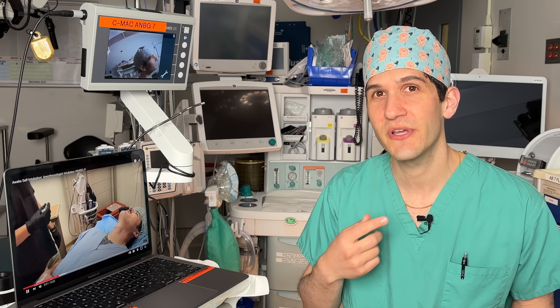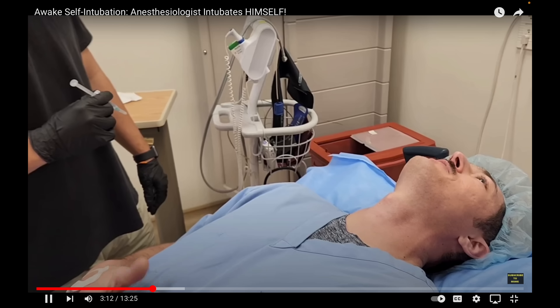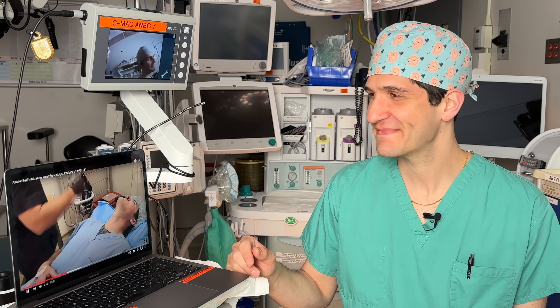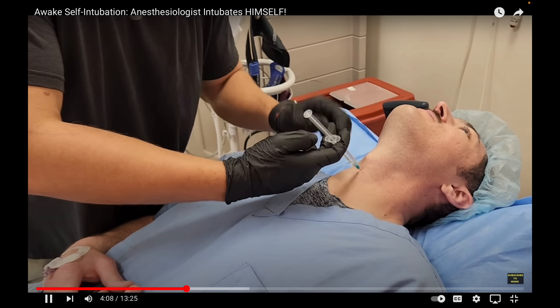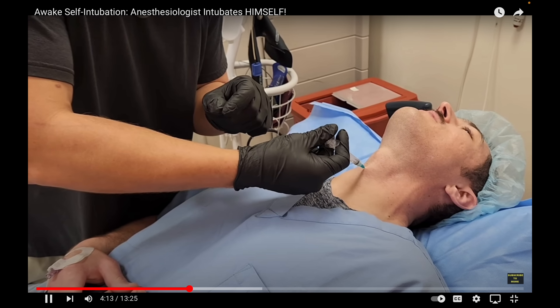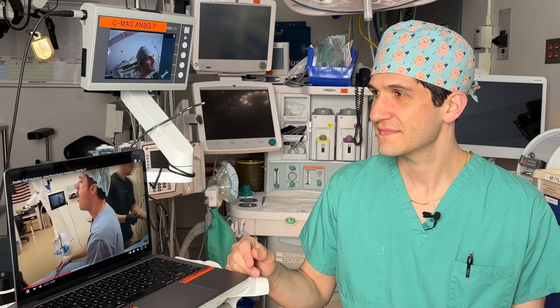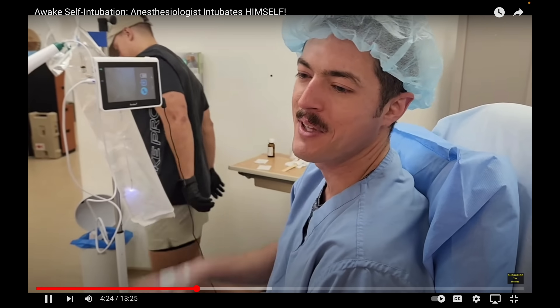The first thing that you'll see happen is that someone's actually going to put a very small needle into the patient's windpipe and spray lidocaine, which is a numbing medication that will coat his vocal cords and a large part of his windpipe. Coughing is good — it helps to spread it up and get the bottom of the cords.